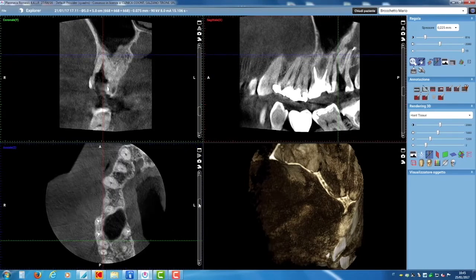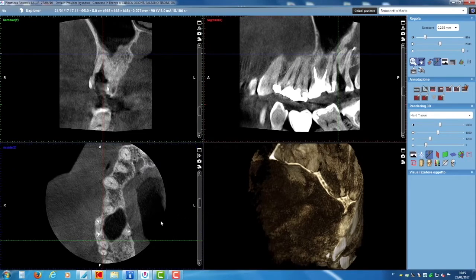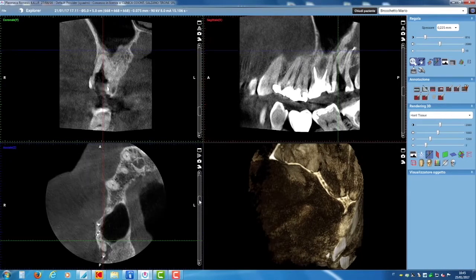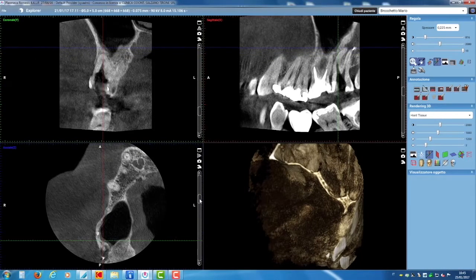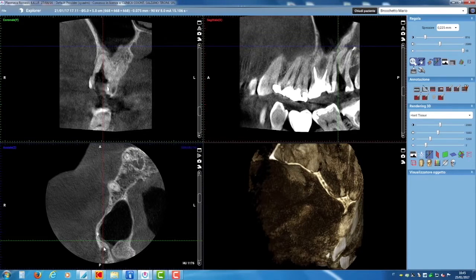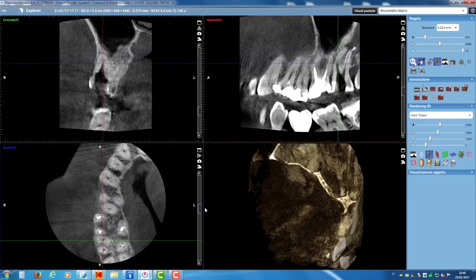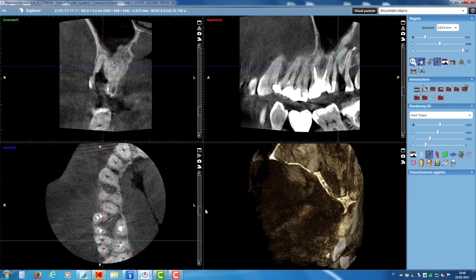You can also realize that this is the starting point of the lesion that actually originates from both the distobuccal and the mesiobuccal canal, as it's clearly visible since the cortical bone is also perforated. So it's absolutely mandatory to find the canal, otherwise one day the patient will have to undergo an apicoectomy or tooth extraction to solve the problem.